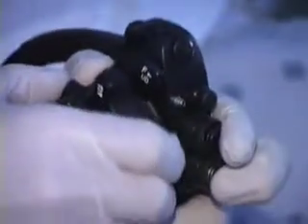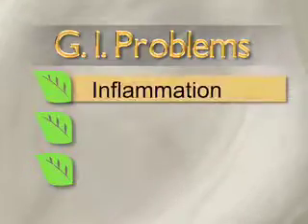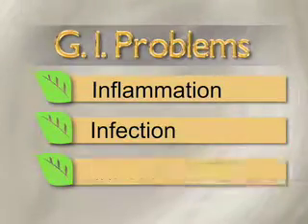When the probe is inside the body, it's much closer to the tissues and therefore gives a much more accurate profile of the tissues, either normal or abnormal, thereby making diagnosis much more accurate and providing opportunities for different types of sampling and treatment. This new and exciting technique of imaging the body has advanced us to a frontier definition of imaging for GI problems. These GI problems, or gastrointestinal problems, range from inflammation to infection to cancer.